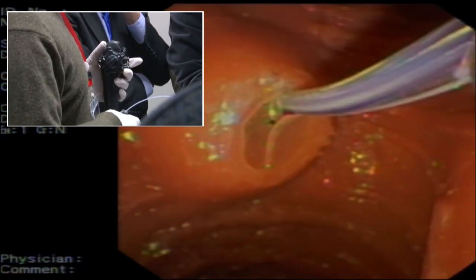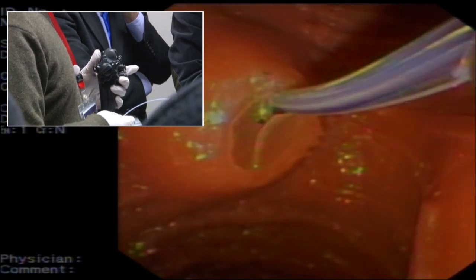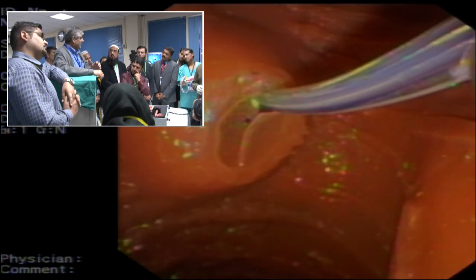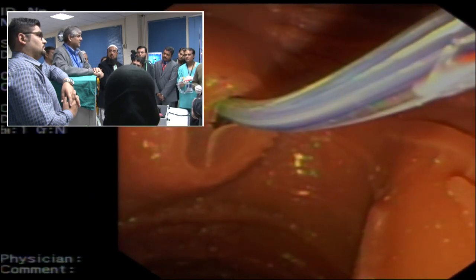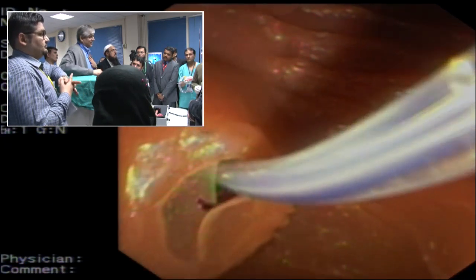The standard straightforward stenting, you don't need anything, you can just elevate. Use the elevator, the big wheel, and you can get it. I try not to use the elevator as much as I can because of the damage and because of the time that it takes. Once the elevator gets damaged, that's it. The scope is never the same after they repair it, for us at least.